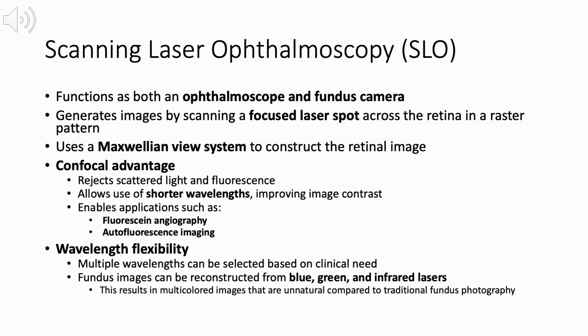Scanning laser ophthalmoscopy also offers significant wavelength flexibility. Multiple wavelengths can be selected based on clinical need, and fundus images can be reconstructed from blue, green, and infrared lasers. This produces multicolored images that differ from the appearance of traditional color fundus photography, but provide enhanced contrast and complementary diagnostic information.